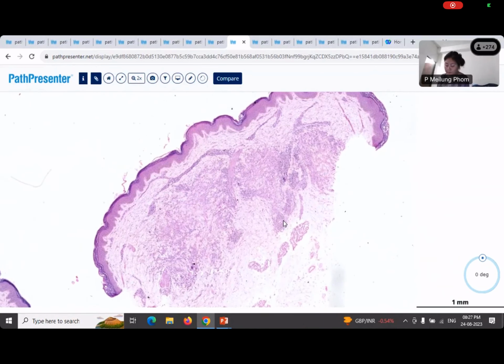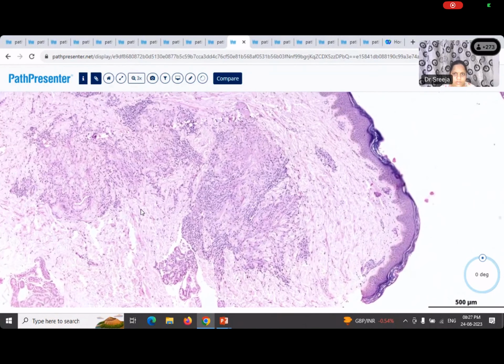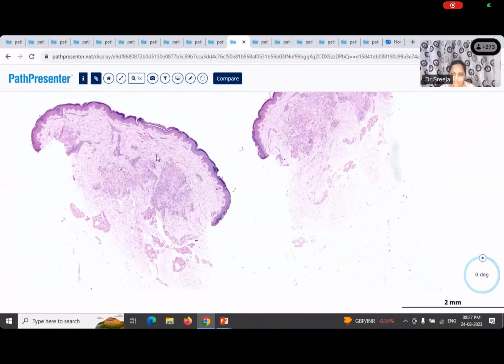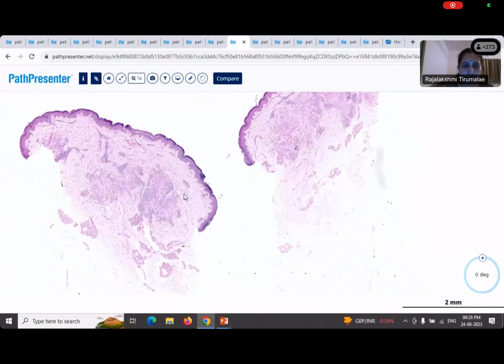Okay. Diffuse dermatitis, and when we say diffuse, we generally mean that it's occupying the entire dermis, so that the entire dermis is obliterated. That's what we mean when we say diffuse. Is that what you're seeing here? Not completely, ma'am. So in fact, you have quite a bit of normal dermis in between, and then you have these circumscribed areas. Here it looks well circumscribed, and here not so much, right? Here it appears more loose or discohesive. So that's what you can make out at scanning magnification. Okay, let's go a little higher. Now you can describe it better.